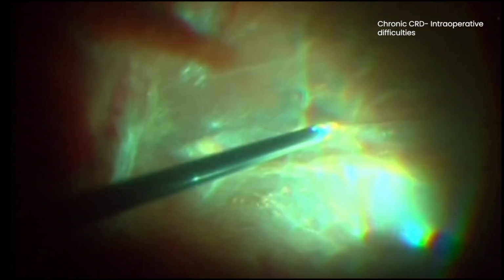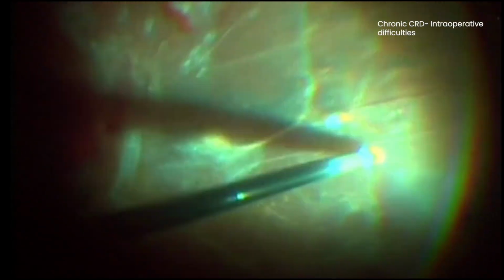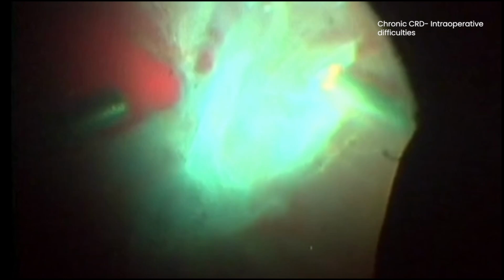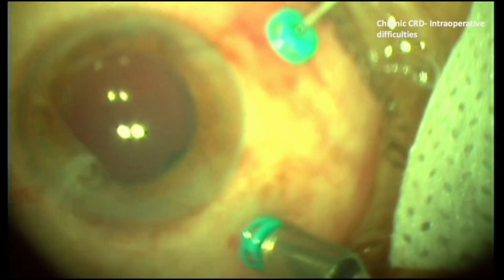The above video highlights the difficult hyaloid separation in case of chronic CRD with subretinal bands. A cutter dissection alone was done in this case. The retina getting bullous can be noted during the instrument exchange. One has to be prepared for such intraoperative challenges. A valve cannula system and preparedness help in closing the case in a desirable way.